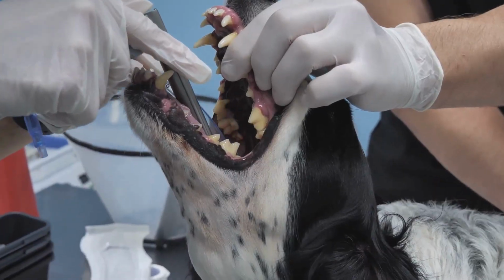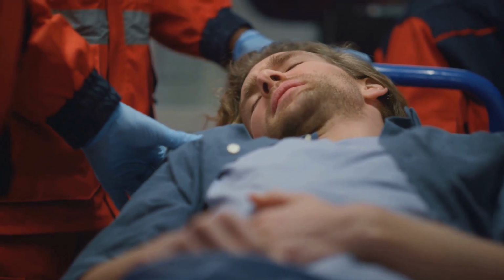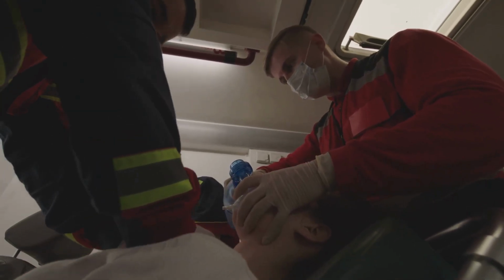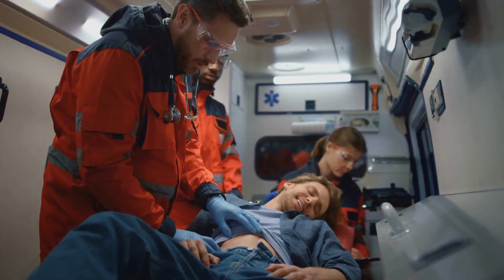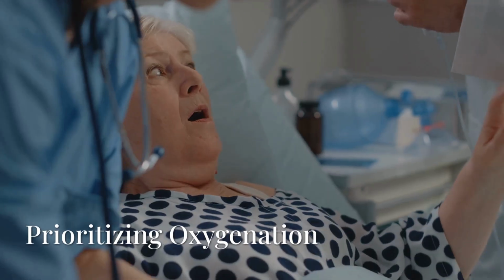If intubation fails after 2 attempts or the patient deteriorates during attempts, go to your backup airway plan. Insert a supraglottic airway, continue BVM ventilation. If all else fails and the patient cannot be ventilated, consider cricothyrotomy or needle crick per your scope and protocols.